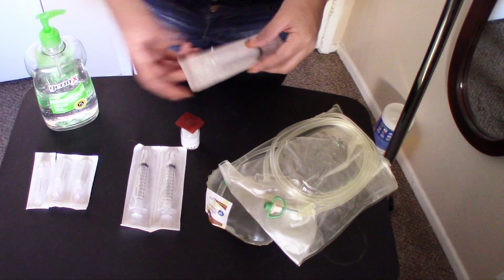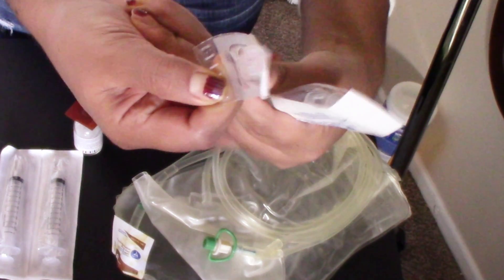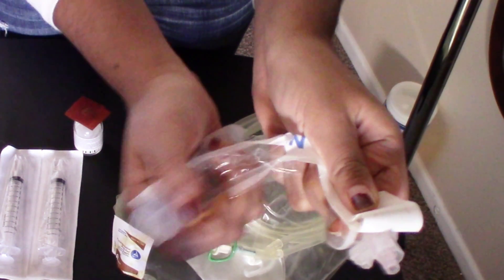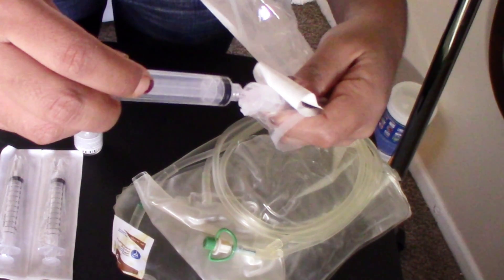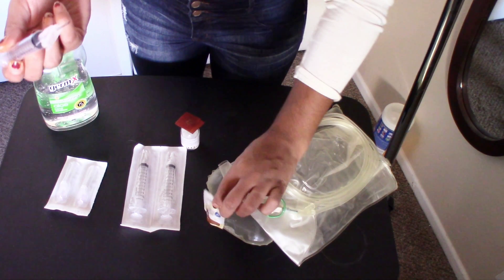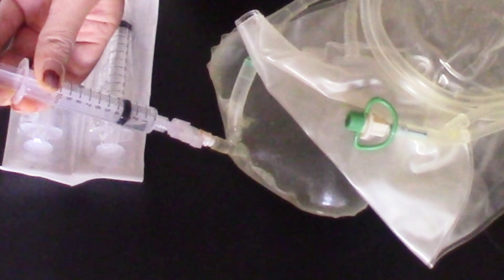Grab a syringe and a needle. We're going to open the needle first and hold the open side of the needle out. Place your thumb on the upper indent of the syringe to open it with ease. With your other hand, squeeze the tip of your syringe to twist off the extra tip, then twist and screw on the needle. Tada! Grab the medication port and insert the needle.